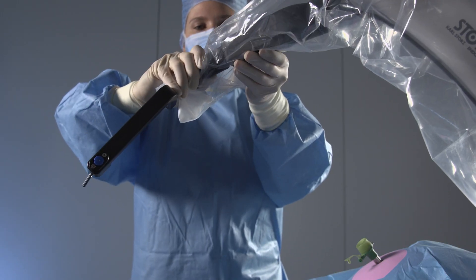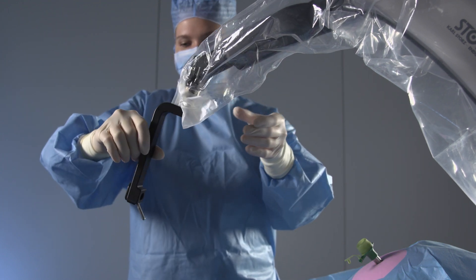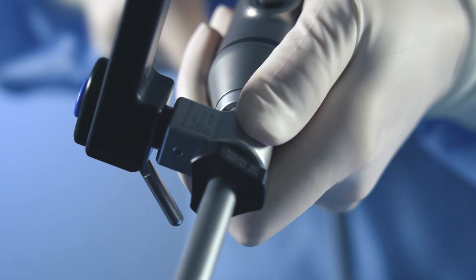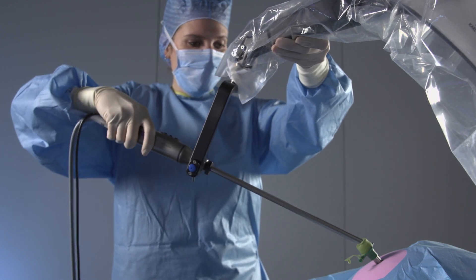Pull down and rotate the cantilever or swivel joint in 45 degree steps to find the best position for your procedure. Secure the endoscope by attaching the endoscope clamp to the universal joint. The endoscope clamp will lock into position with an audible click.